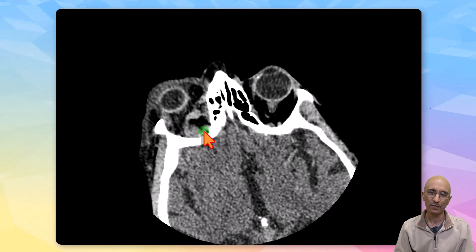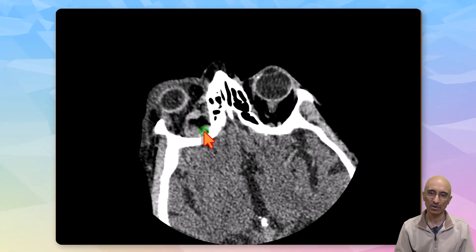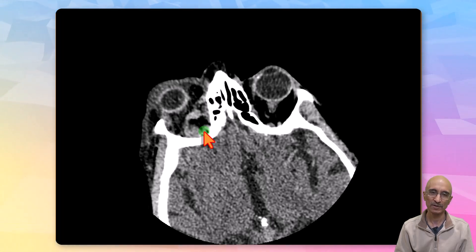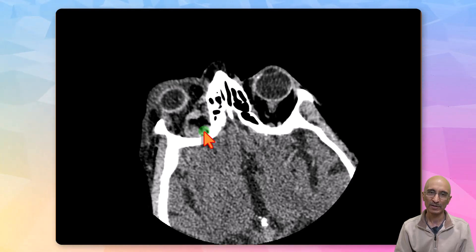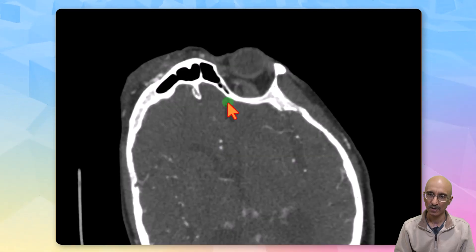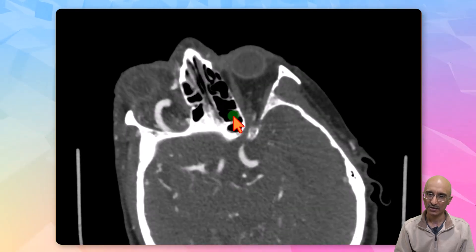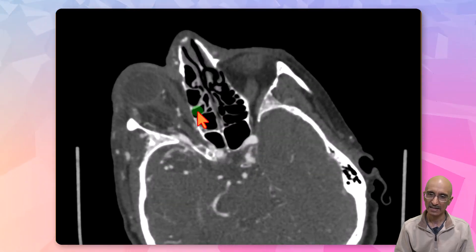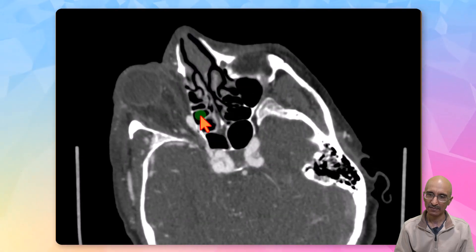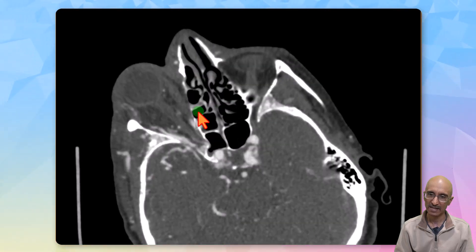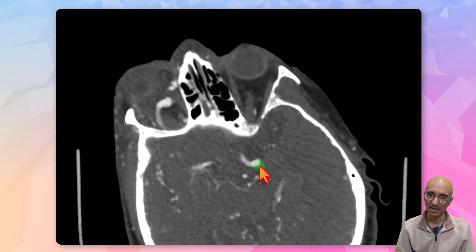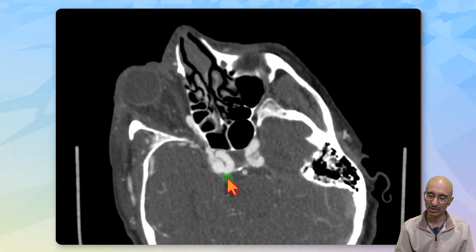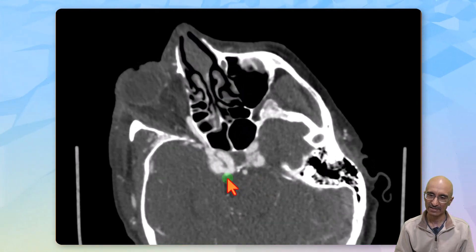Due to concern for superior ophthalmic vein thrombosis of unexplained etiology, the patient was referred for a CT angiogram examination. On the CT angiogram examination we can clearly see a markedly dilated superior ophthalmic vein which has the same density as the arterial system, in the region of the right cavernous sinus.